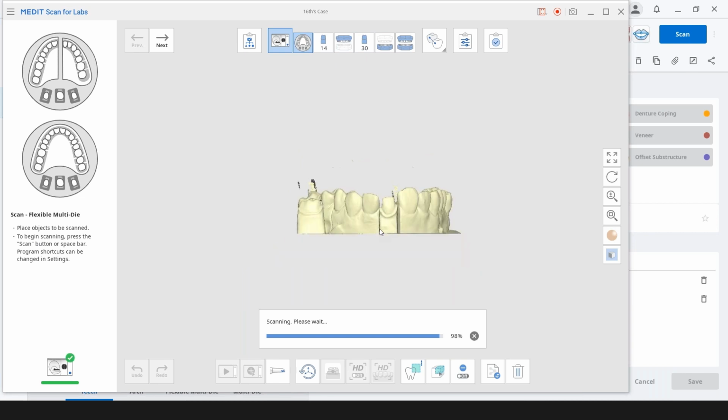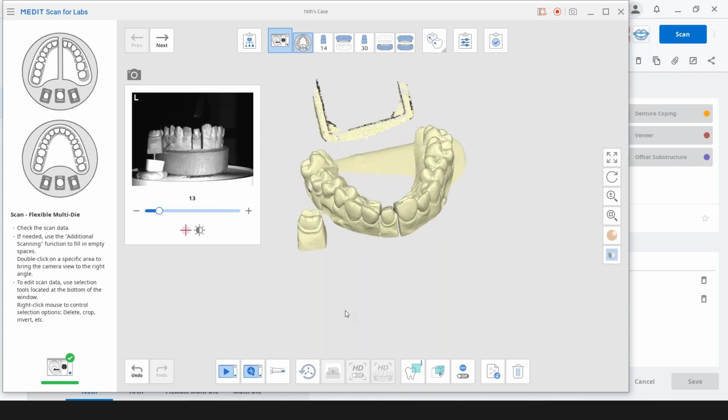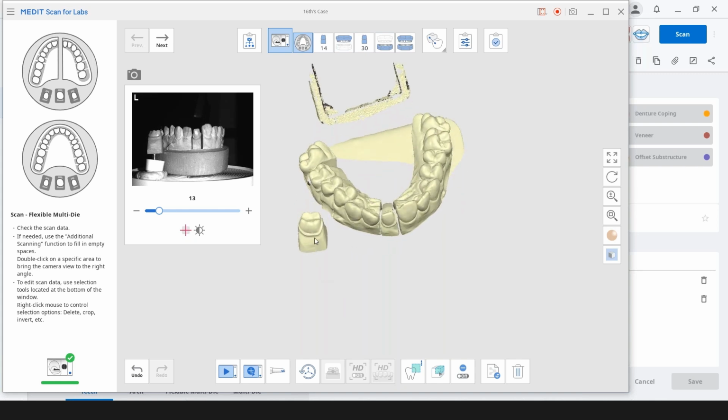And one thing I want to mention about putting the models on the plate: you want to have the anterior pointing towards the camera. So what I did is I put a black magic marker dot on my plate, and I just mount the models with the centrals facing that mark. The same could be said for the dies. You want to get your buccal margins towards the camera, if at all possible. If you can't, it will still pick it up, but it's just nice for alignment and registration later.